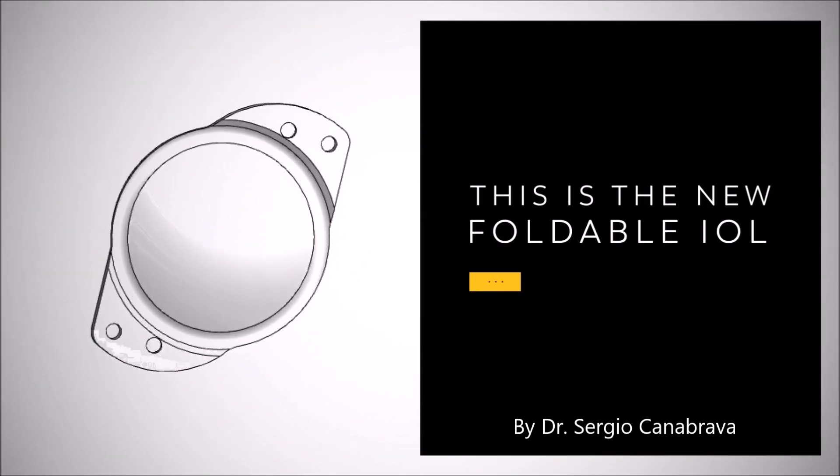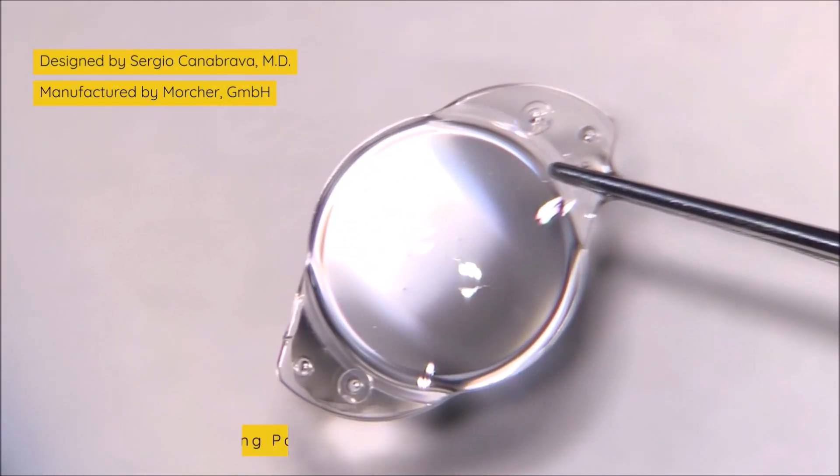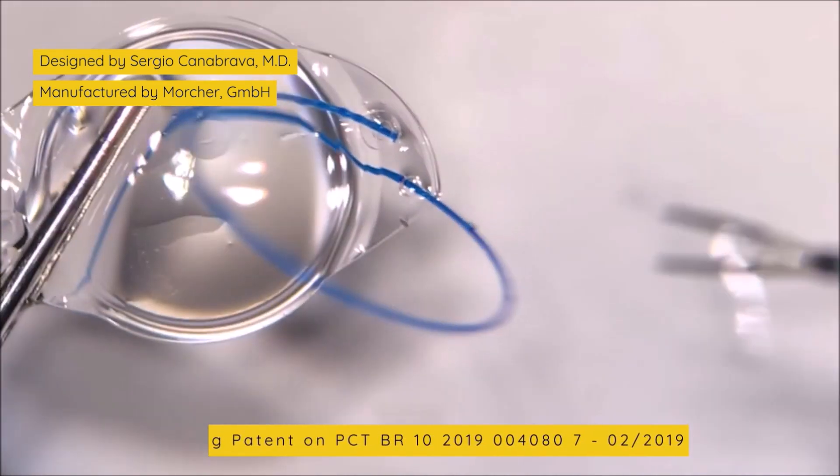This is the new foldable IOL. The new IOL has been manufactured in hydrophobic acrylic and with four eyelets. You can observe that we pass the proline through the eyelet like a shoelace and make the first flange.